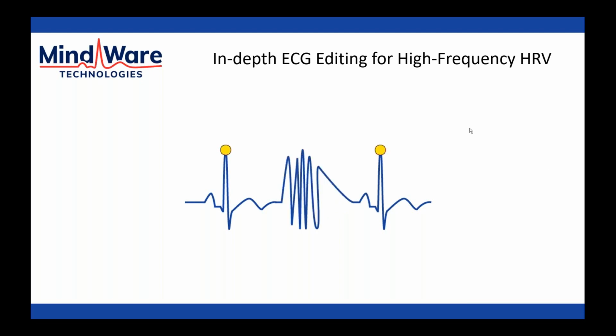And then there are those situations where the signal is completely obstructed by some sort of noise. And when that happens, we can't really know for sure where to place our R peak. So we just have to do the best we can. And in this case, we need to estimate where it might have been had we been able to see it. And we would do that simply by inserting a midbeat, which we'll talk about again once we get into the tool. But it's our way of estimating beat location while maintaining a continuous series of R peaks and minimally affecting our statistical output. And there are some rules around how often you can do this as well.